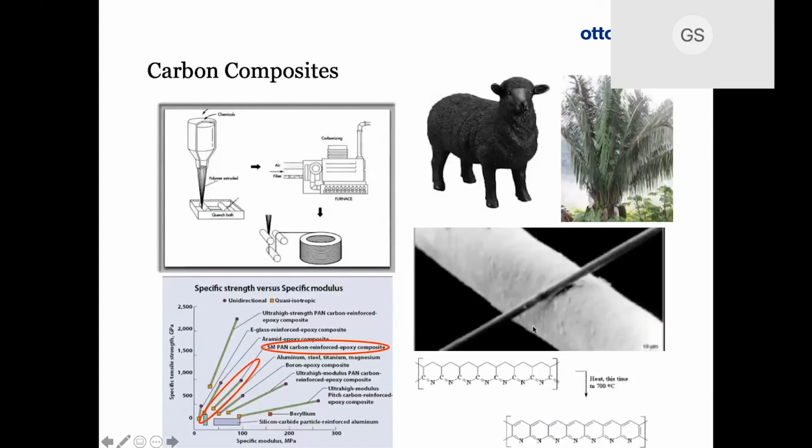And here you can see just how small carbon is. It's about 6 microns, and that's a human hair right next to it. So you can see how small carbon is, and look at the cuticle that's on the carbon. It's very smooth, so this makes it very difficult to bond to each other. And then you can see the human hair has a certain degree of cuticle, which allows actually better bonding. Not that you would laminate with human hair, but you get the idea, right?